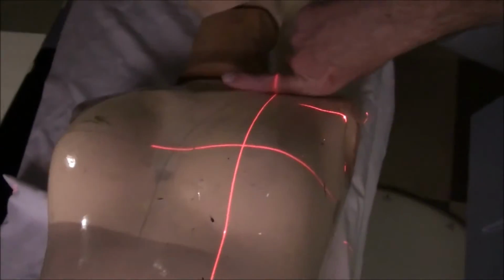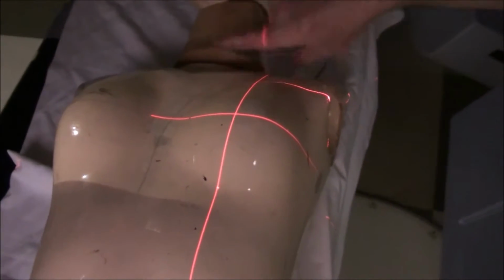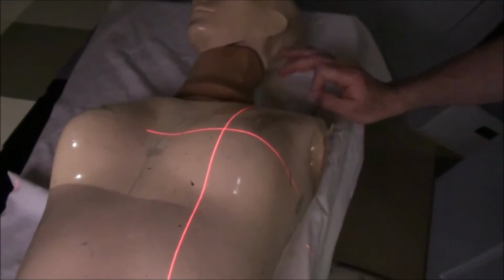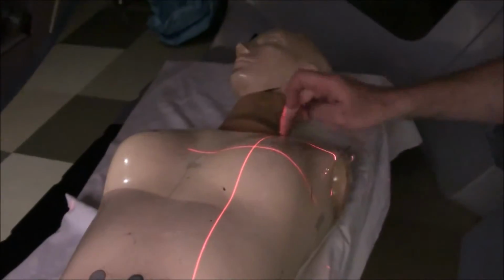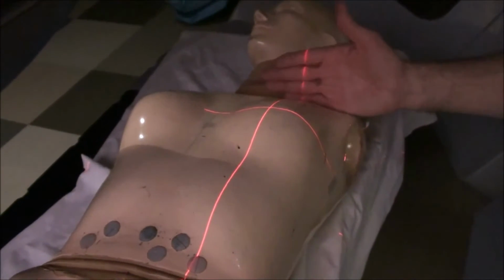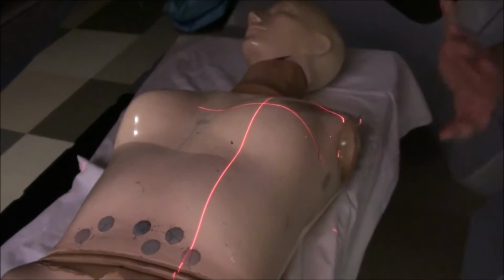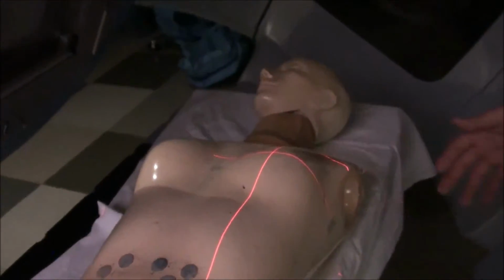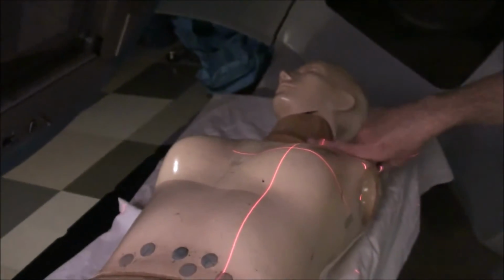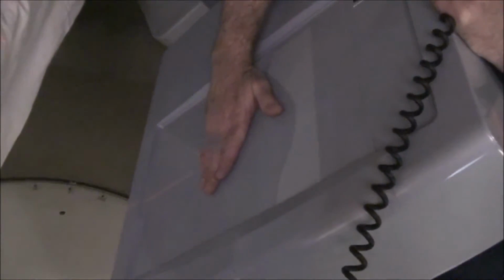The superior edge of the breast tissue is usually about the sternoclavicular joint. What's usually going to happen, though, is the doctor's going to come in and put marks on the patient where he wants the entry and exit point, where he wants the superior and inferior aspect of the patient to be. I'm just pretending I'm the doctor and I'm going to do all of this. So, sternoclavicular, 1 to 2 centimeters of flash.